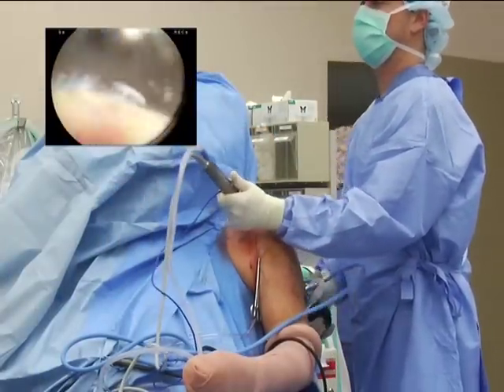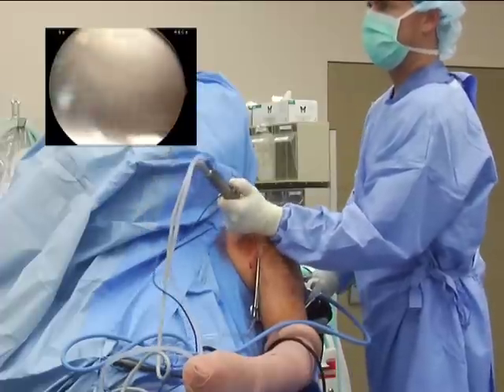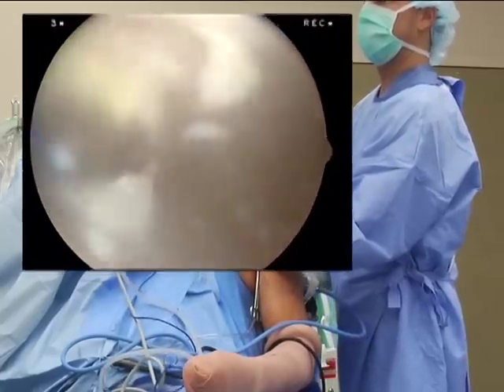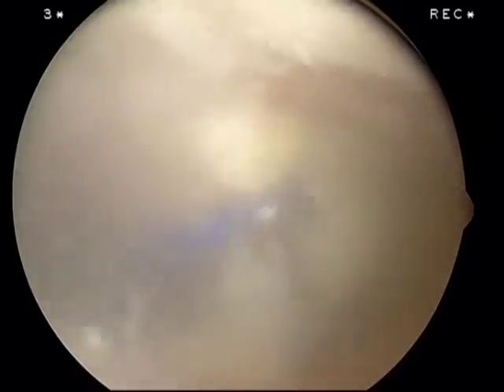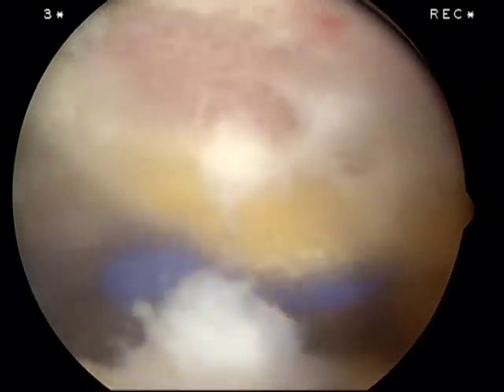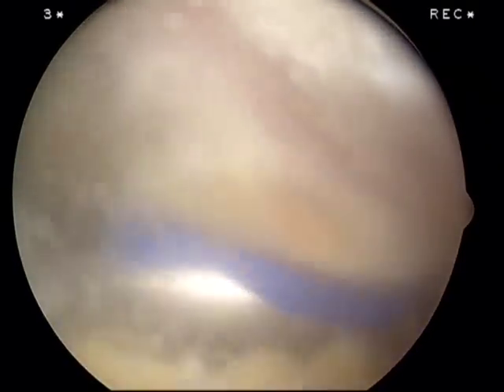What you'll notice through the whole case — while we're doing the decompression, and I am going to do an AC resection on this individual — is I never change the instrument. It's always the same instrument the whole time, no matter what I'm doing. You should count how many times during a single case you change instruments; that helps you realize one advantage of this device. You could get somebody to take a stopwatch and time how much time it takes with all those changes — I think you'd be surprised. Just the time alone you spend changing.